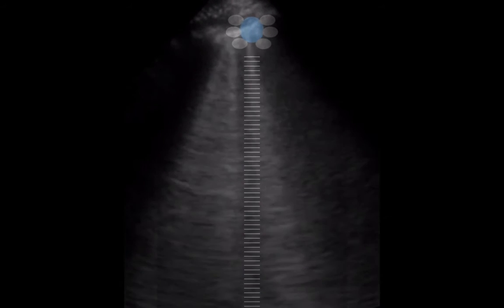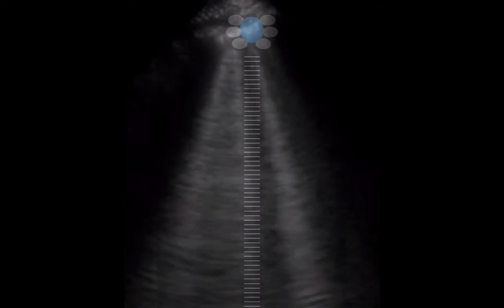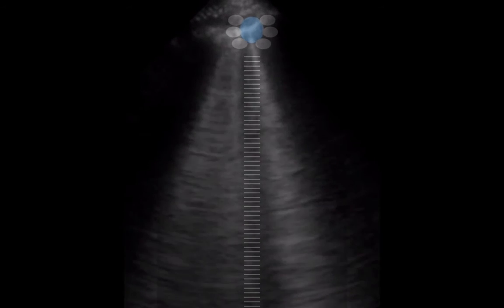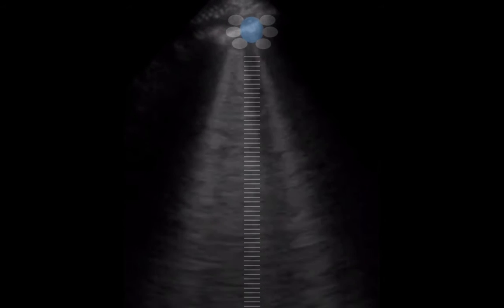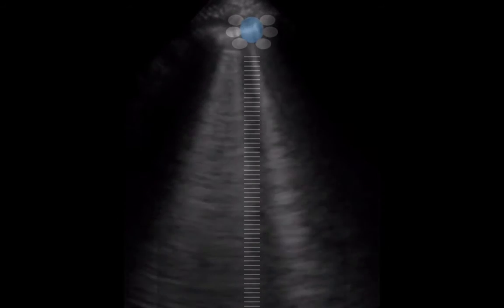Okay, so what about, I've heard about this interlobular septal thickening thing. Right, so that is definitely a component of how B-lines are formed. So the theory is, as you get fluid in your interlobular septa, the spaces in between your terminal sacs of alveoli, that it creates the B-lines. And that's definitely a component, but I think that it's more than that. I think on top of the interlobular septa being thickened, the alveoli themselves can form these B-lines as well.